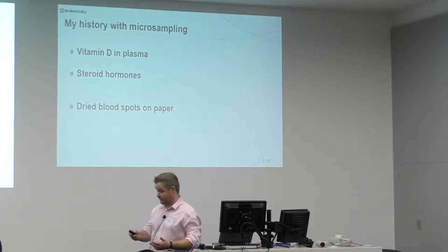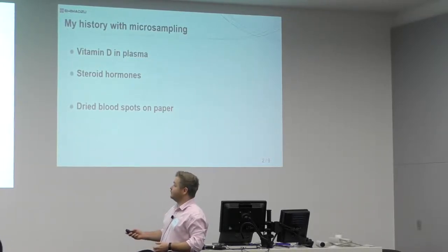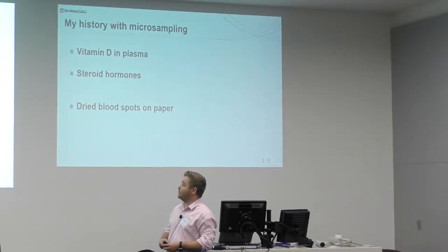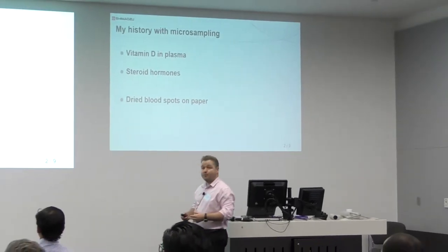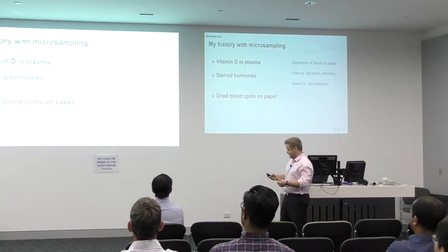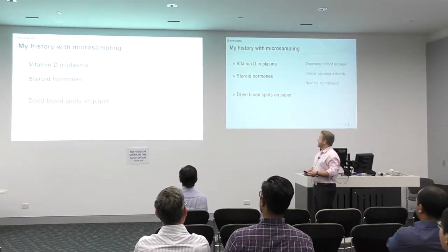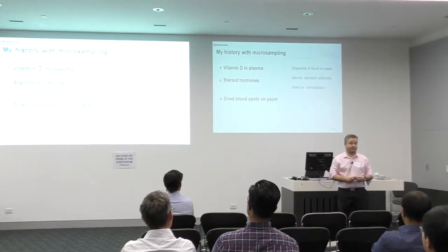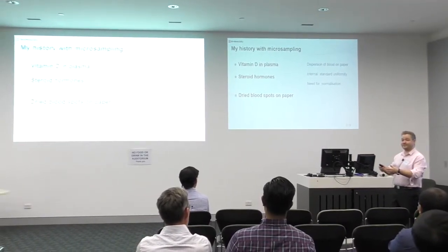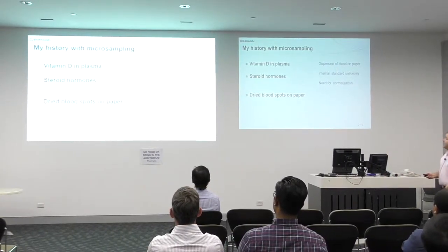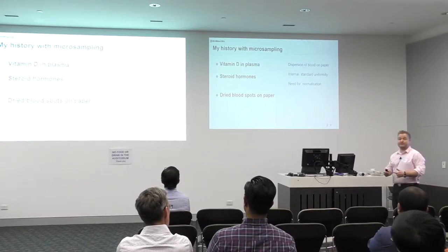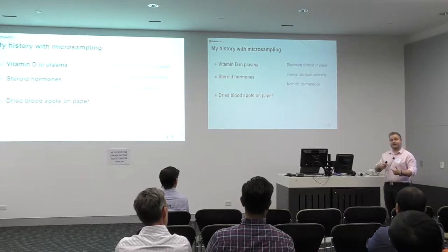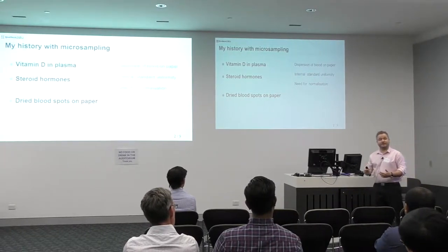I've got a limited history with micro-sampling. The first time I encountered this was when I was looking at endogenous metabolites in plasma — things like vitamin Ds and steroid hormones — and I was asked to look at these on dried blood spots on paper. I found that I couldn't get uniform dispersions of blood, I couldn't get internal standard uniformity when I spiked internal standard onto the card, I couldn't punch the cards very well, and I was doing it by hand. I really thought there was a need for normalisation of the compounds of interest compared to something endogenous in the sample, and I couldn't really find an easy way to do normalisation.